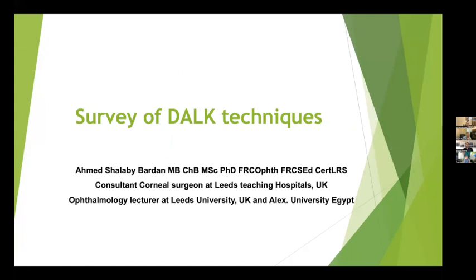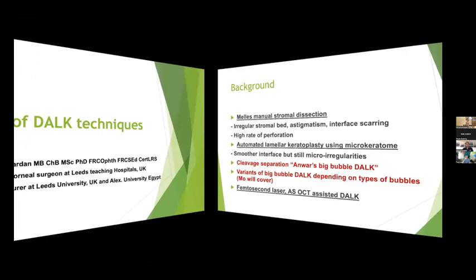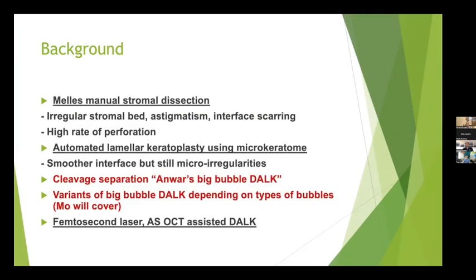Some of these DALK techniques have been introduced, have stood the test of time and test of competition. Some have not, some have been withdrawn, and the surgeons now focus on a few of these techniques. So, no financial interest to disclose. As a quick background, Melles has introduced the manual stromal dissection DALK. That has actually been the technique used by most surgeons for some time until Dr. Anwar introduced the cleavage separation, or the big bubble DALK.